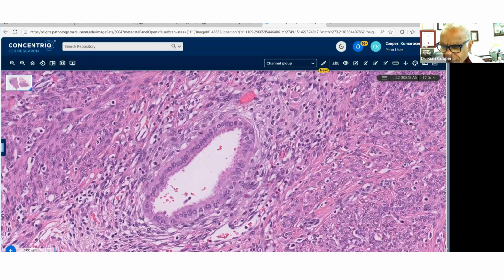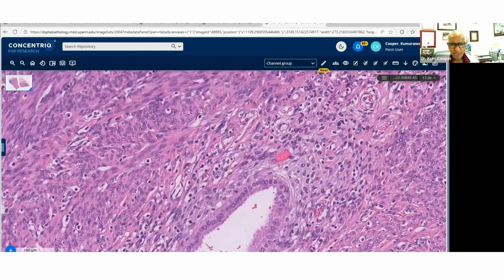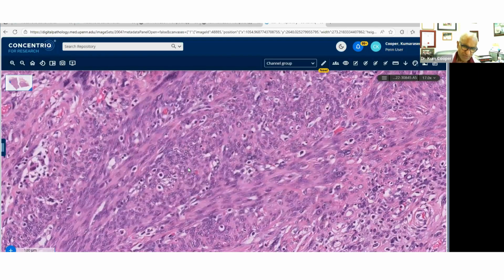I was just happy calling it an adenomyoma, extrauterine and of Mullerian origin, because I had the markers to prove that as well. Was it expressing ER and PR? Yes, it was expressing ER. I did not do a PR. I just did ER and WT1, excuse me, which is positive in the smooth muscle cells, which told me this is of Mullerian origin. All right.